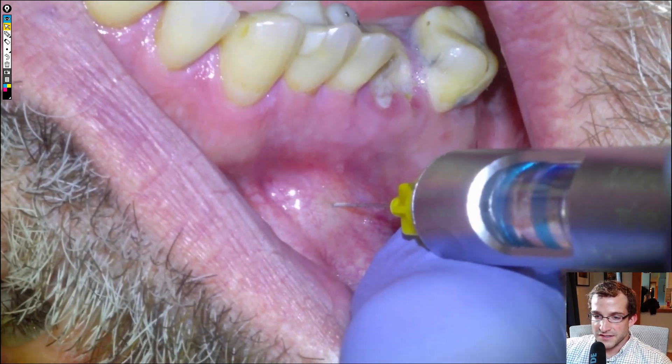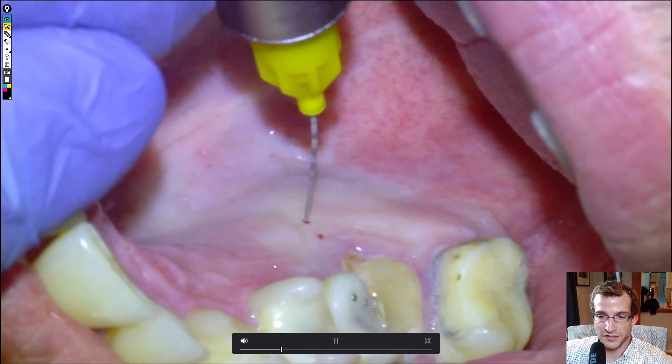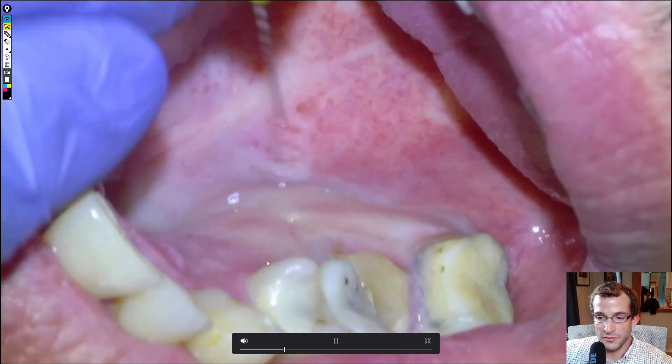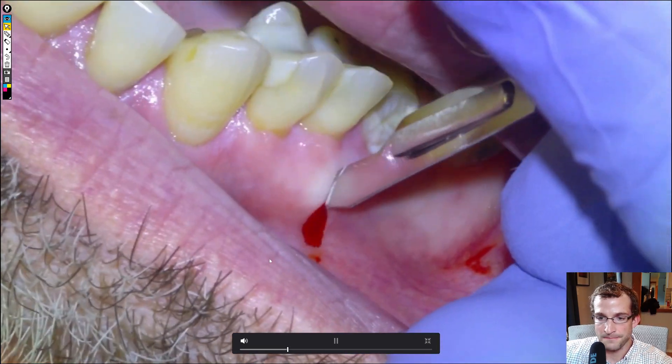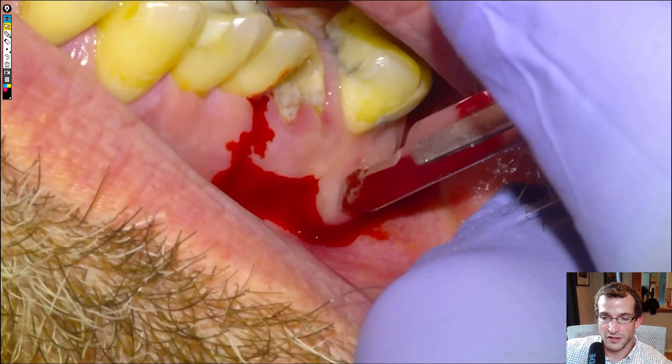We'll anesthetize the buccal with 1-200 articaine. You'll see a lot of bleeding from the needle puncture, and then the palatal. The patient is on anticoagulant therapy, and you'll see a lot of bleeding from the incision as well. It's not worth stopping anticoagulant therapy because you risk having a clot block up the brain or the heart, and you have to lose a lot of blood for it to be significant systemically. So even for a surgical tooth extraction like this, it's not necessary to cease anticoagulant therapy.